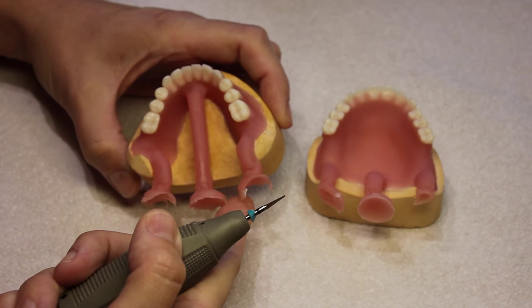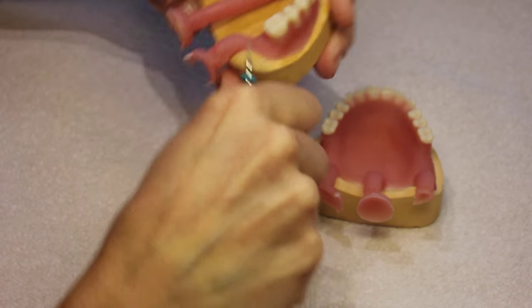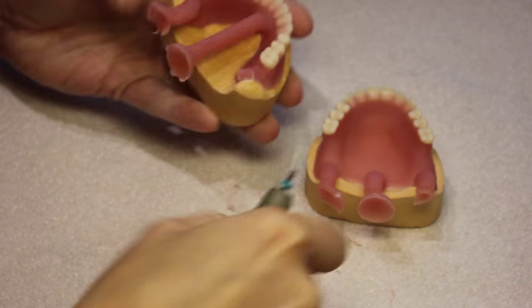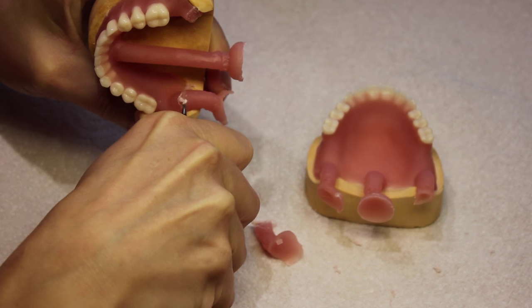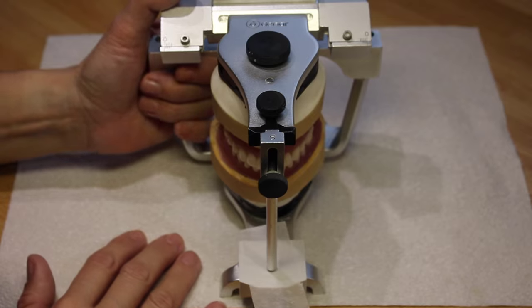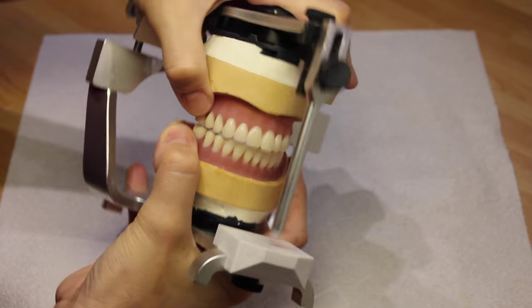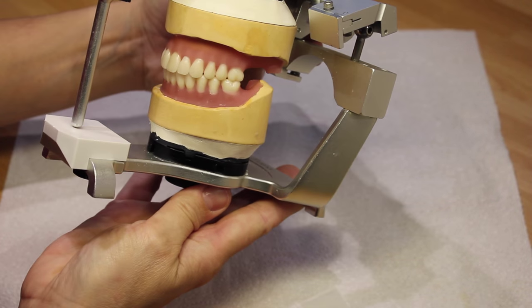We've now got to remove the channels — I favour a tri-cutter for this but any acrylic bur will work. After removal of the sprues, get the model back on the articulator, check that your pin is down and check your occlusal contacts, before a very brief bit of final trimming and polishing.